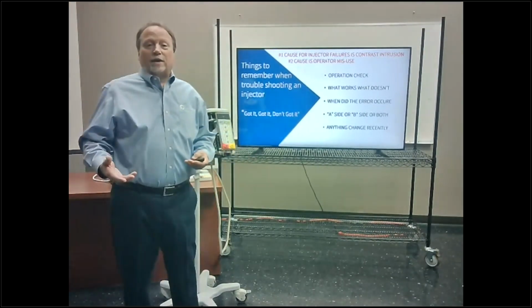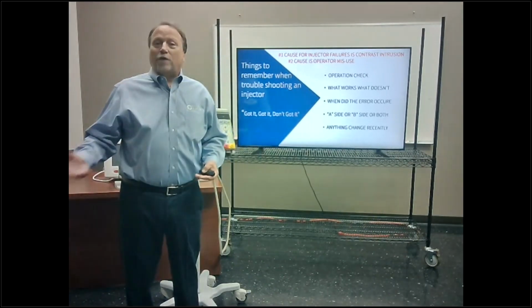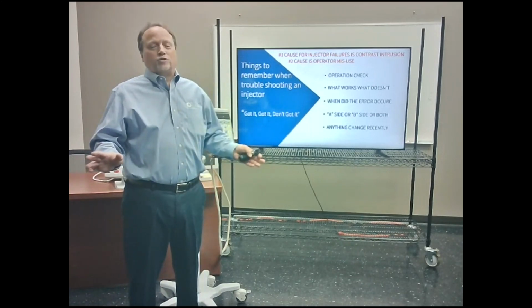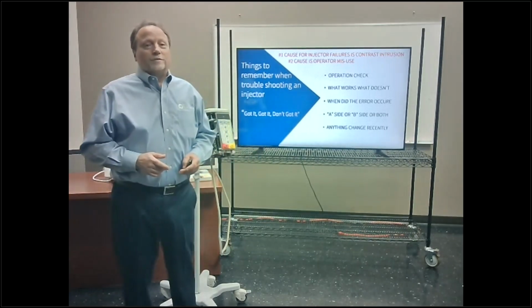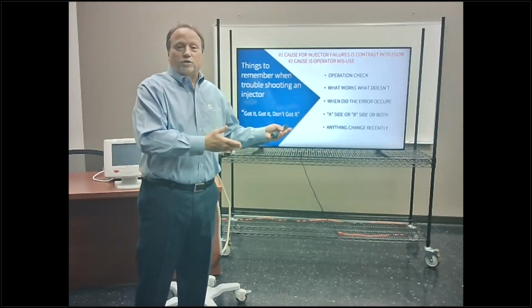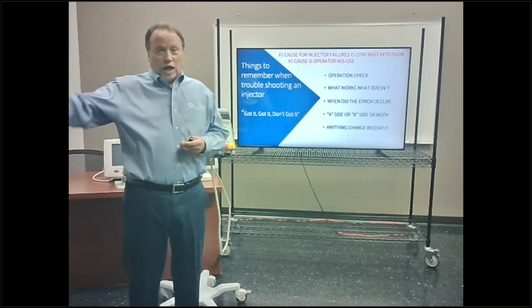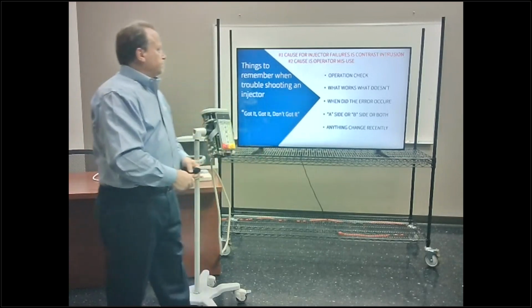Whether it be power coming out of the wall, like it won't turn on, okay? Do you actually have power coming out of the wall? You do. Take it to the next step. Do you have power to that power strip? Now, we all know power strips are never, ever used in the hospital, but someone could turn it off. Now, you have no power, and you follow right up to your injector, and then if you have power to the injector, it's an injector problem. You move from there. So got it, don't got it, there's your problem.